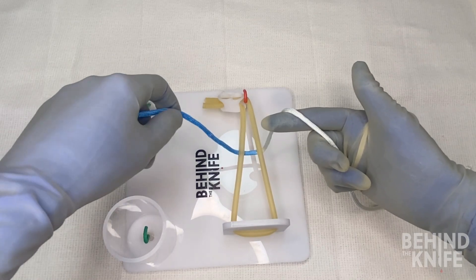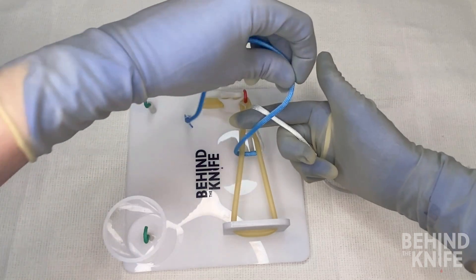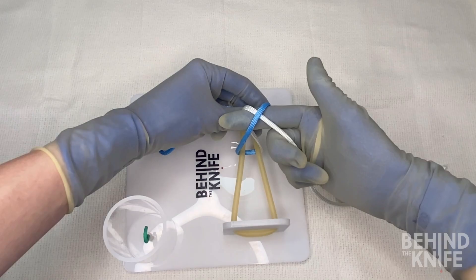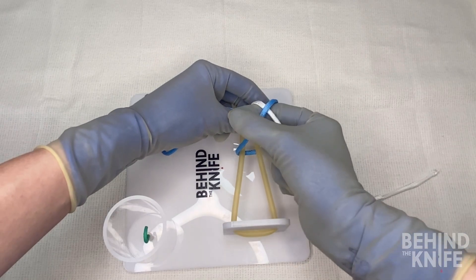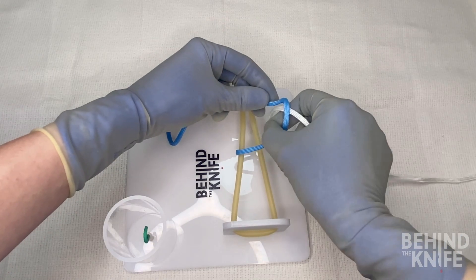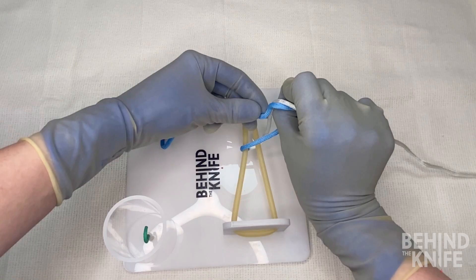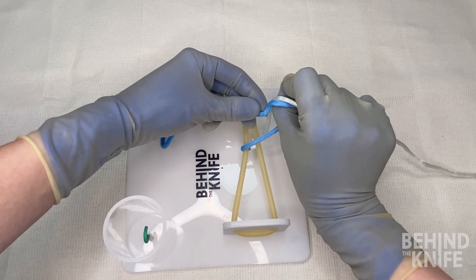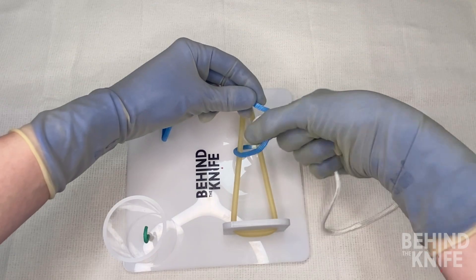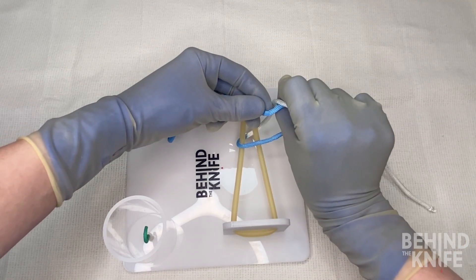To start, we'll take the string that's in our left hand and cross it over our right index finger to make an X. From here we're going to pinch our thumb and index finger together and rotate our fingers so our thumb goes through the loop and our index finger comes out on top. We'll rotate our fingers so now our thumb is on the bottom and our index finger is on the top.